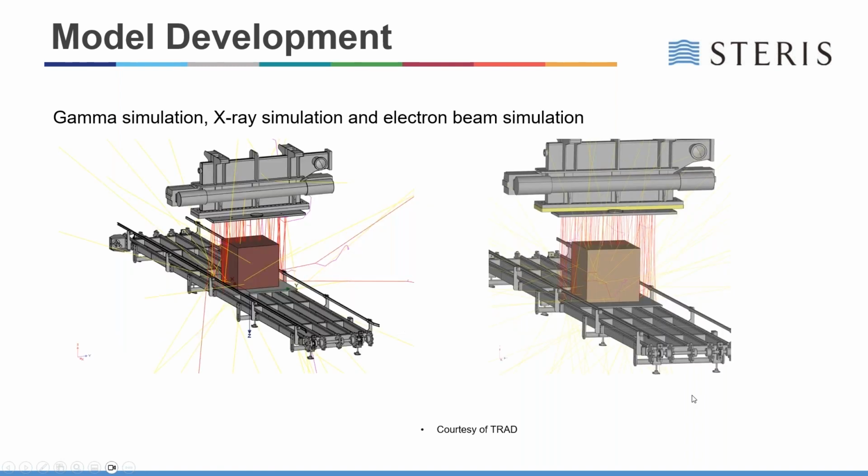Finally, we'll look at the individual electron tracks going through an e-beam processing facility. And this type of information is helpful. It can be used to visualize the penetration depth of those electrons and understand the dose variation that might be present given the changing product packaging size. And once benchmarked, you can even anticipate the change in dose distribution due to changes in the product packaging that's shown here left to right with alternate materials being irradiated under otherwise similar conditions.